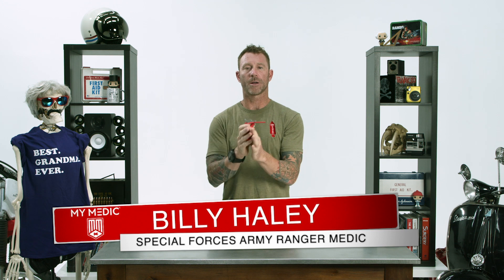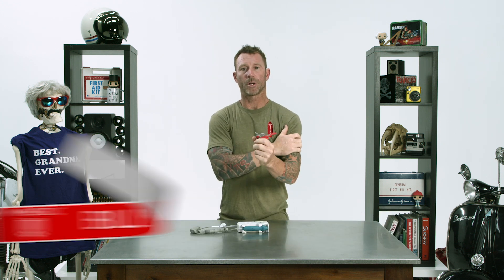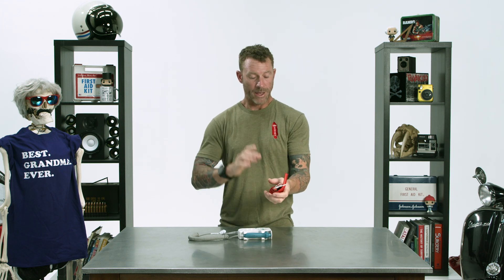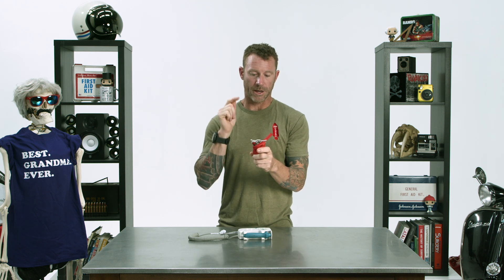Today we are putting the rapid tourniquet to the test. I'm going to put it on properly and use this Doppler machine to see if I can pick up a radial pulse. If I cannot pick up a radial pulse after putting this on properly, we know this is an effective tourniquet. Pick whichever tourniquet you're most comfortable with and make sure it works 100%, because a tourniquet that doesn't stop a life-threatening bleed isn't a tourniquet at all — slowing the bleed is not what we're after. We're trying to stop the bleed.